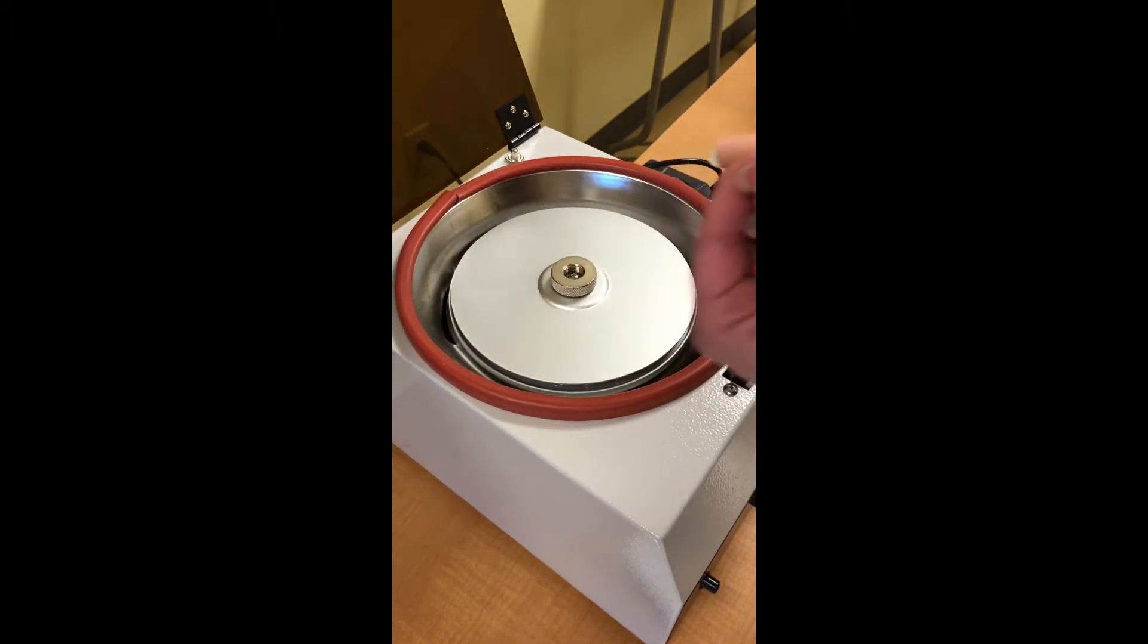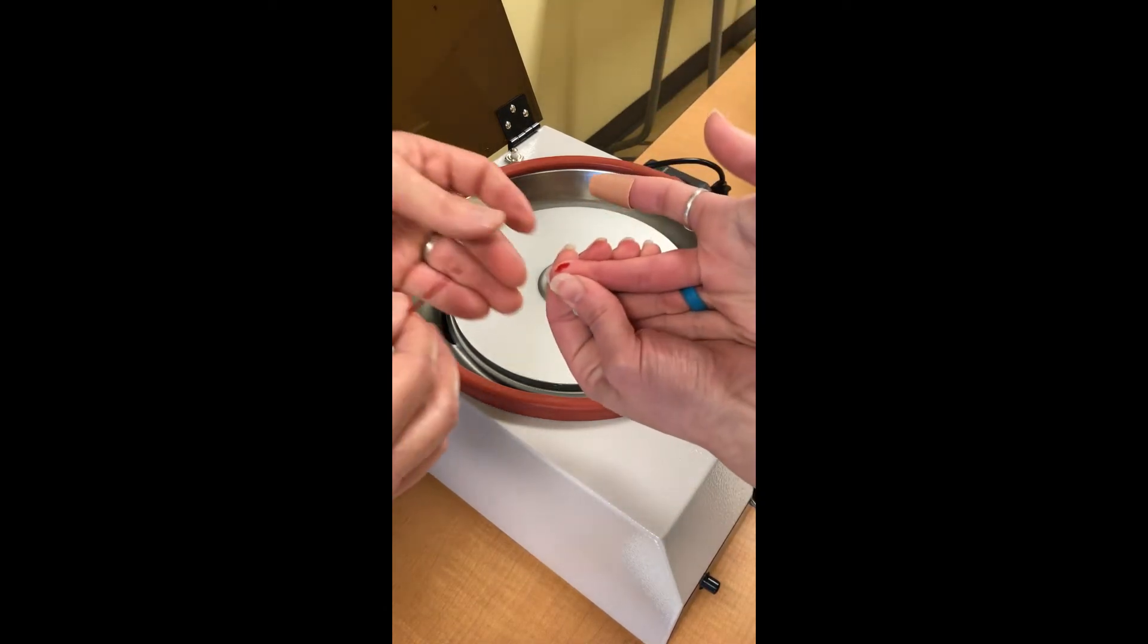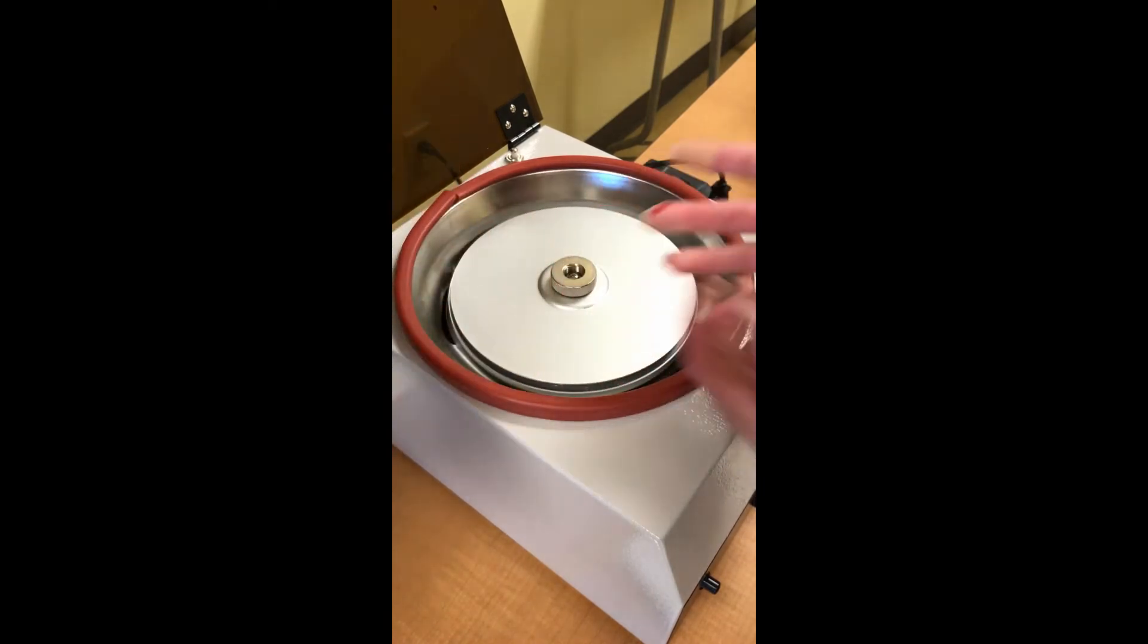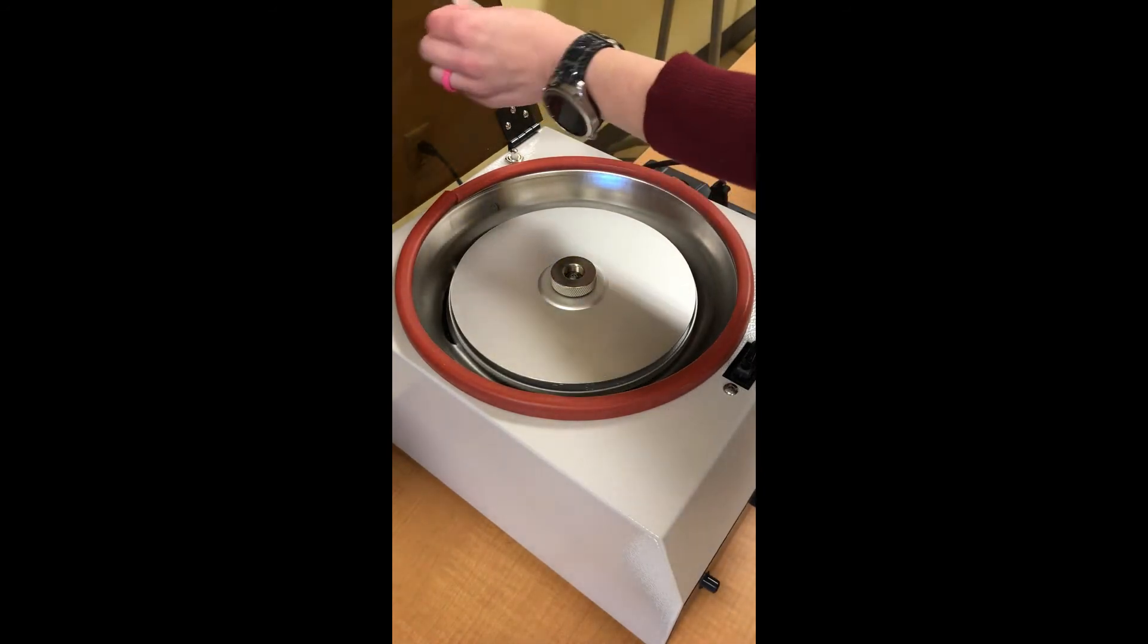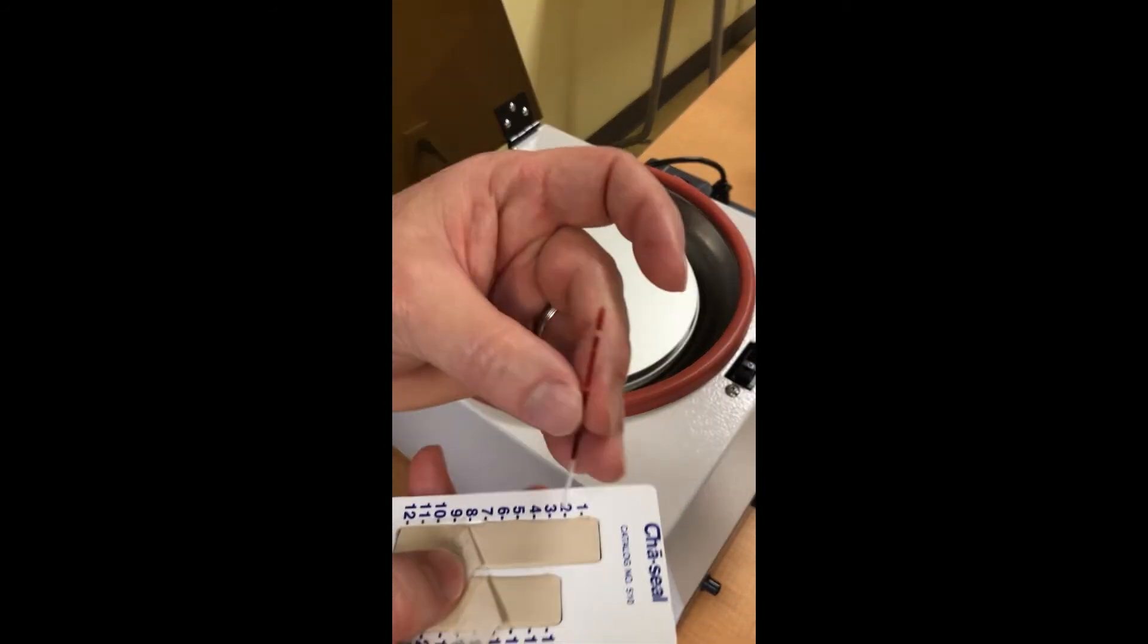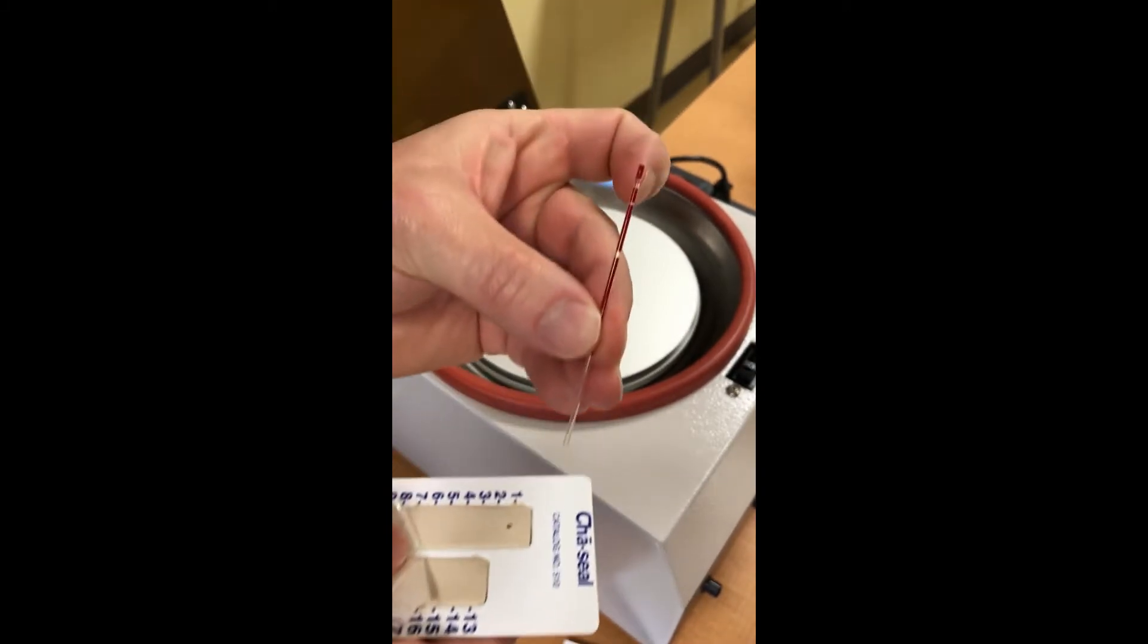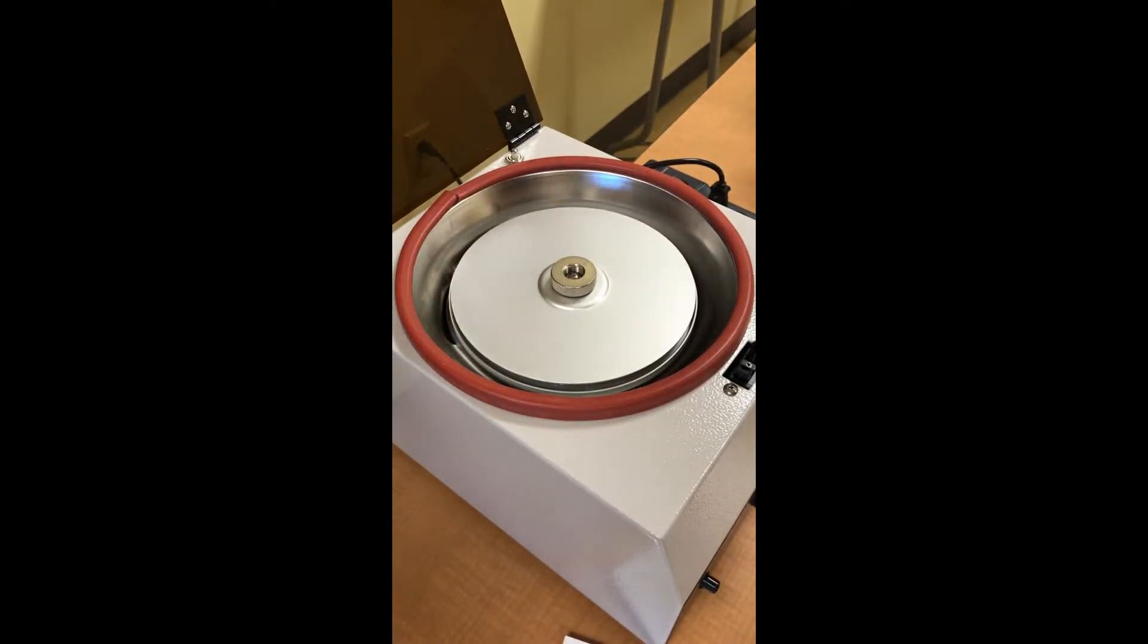Okay, slowly filling up. Just a little bit more and we'll be there. A few more drops. All right, let's see if we can go with what we got right here. So I'm just going to take this little stuff - it basically has the consistency of play-dough - and I'm going to plug that end, and I'm going to do the same to the other. There we go.